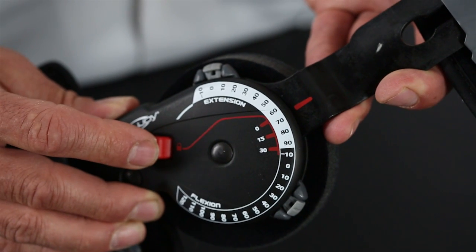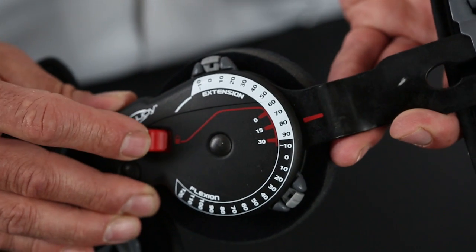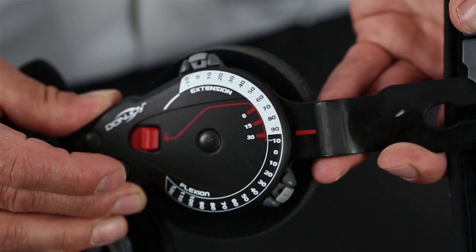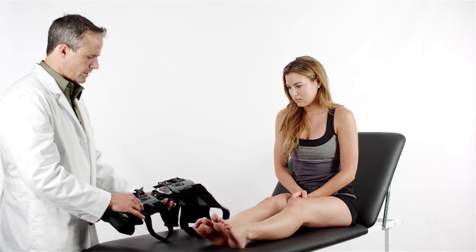To use the Red Quick Lock feature, slide the button inward until the lock is engaged at 0, 15, or 30 degrees. Make sure the uprights do not rotate.